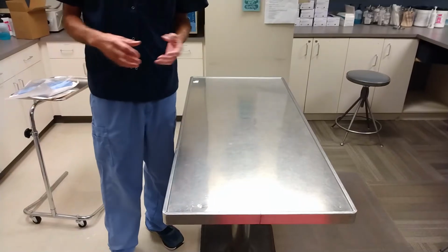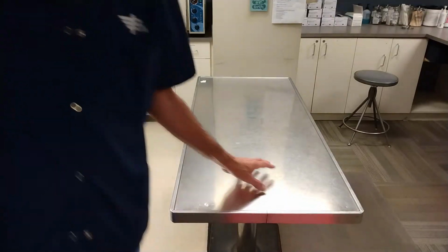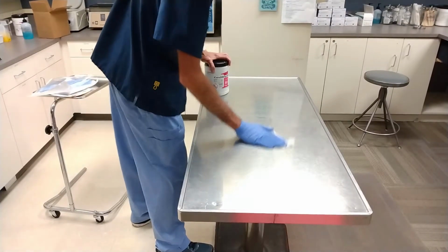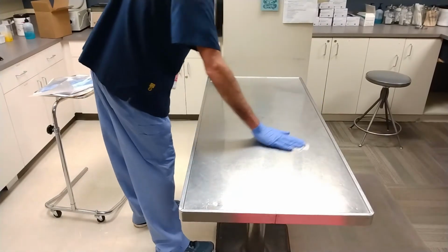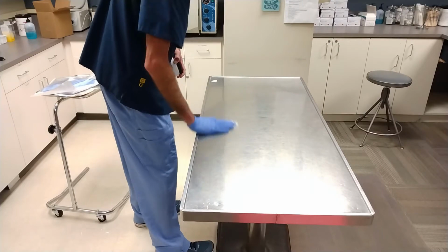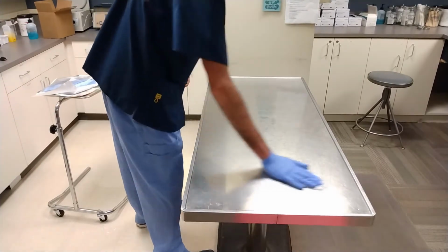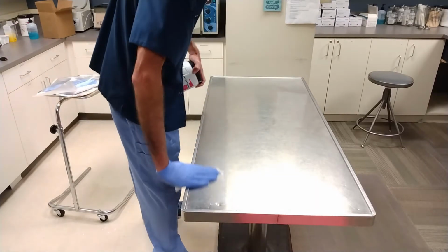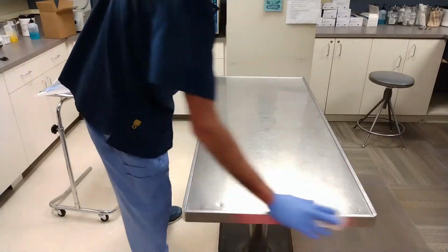When you're working in a surgical setting, you want to have a back table. I'm just going to use this because if I'm scrubbed in, I'm not going to be able to open up or even pick up the package, right? So I'm going to clean my area, starting in the middle, just like we did for the Mayo stand, right? Make sure any dirt on there gets swept out to the outside.